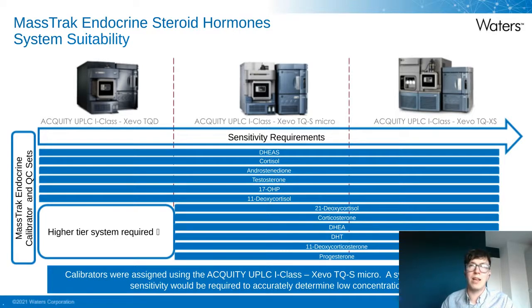So just to emphasize, as part of the manufacturing process, the calibrators were assigned using the Acquity UPLC I-Class with Xevo TQS Micro system. So we would typically advise that a system of equivalent sensitivity will be required to accurately determine the low concentrations across all 12 steroid hormones.